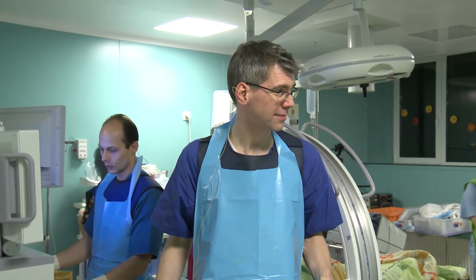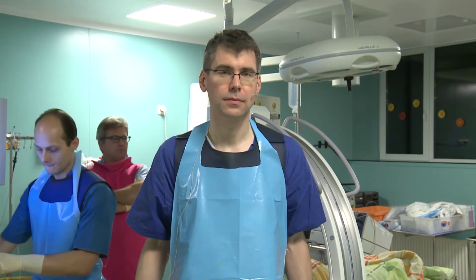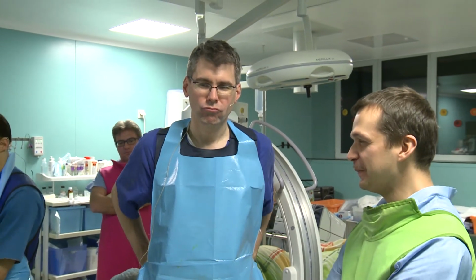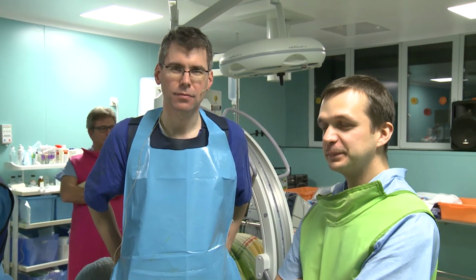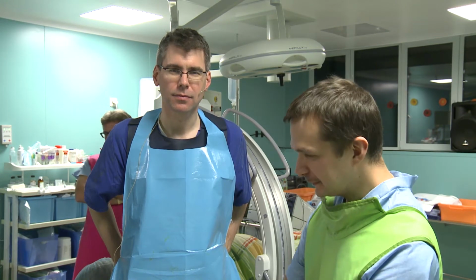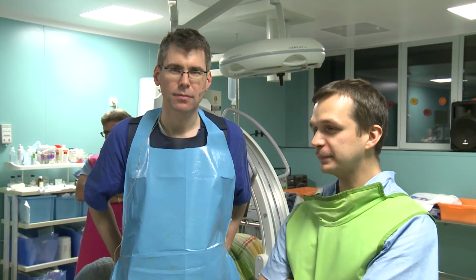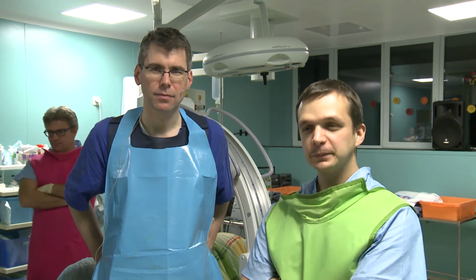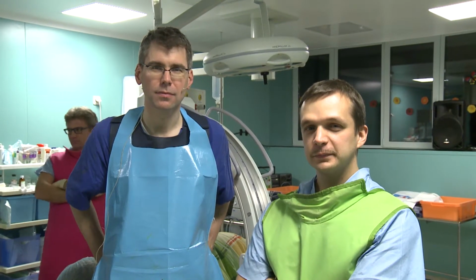Sergey, what do you think about this procedure and the perspective, so to say, of taking that material, not only cytology, but histology as well? Well, with regard to cytology, with brush biopsy, it's quite promising, and it depends on the pathology when you do it.